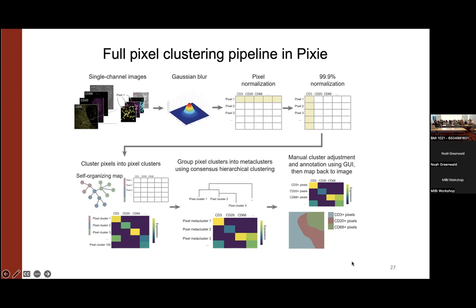Yeah, you can think about using the pixel clusters as another mask for object detection, if you want to detect a certain object that's defined by a pixel cluster and find a larger contiguous region, like this is the object. We can also think about ways of doing that. I think the possibilities are endless, what you could do.